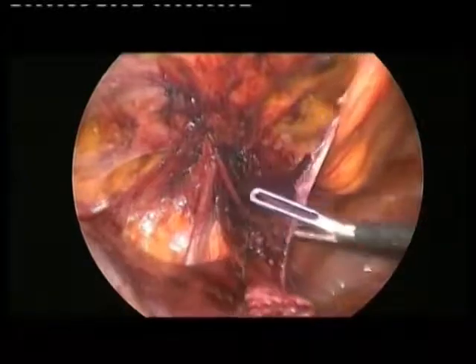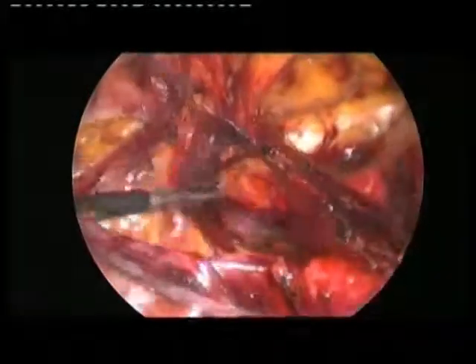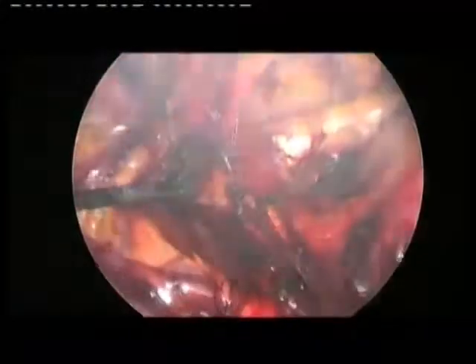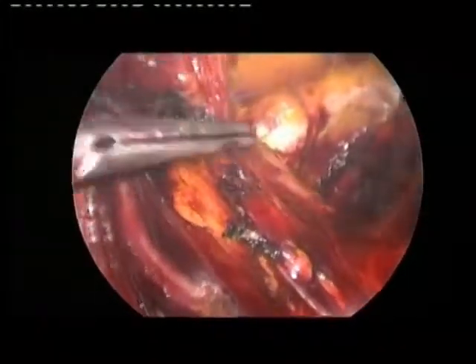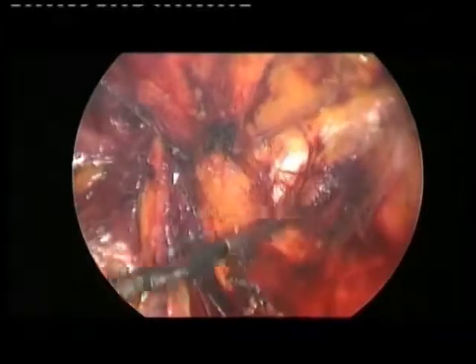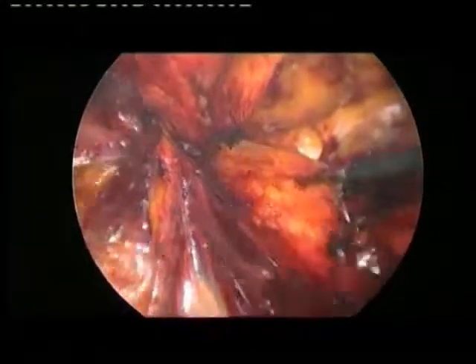Now we are going to work on the crural hernia, okay? The very important advantage of this approach is that you can check all the sites of hernia and you can repair all kinds of hernia. Okay, you see? This big crural hernia is very unusual in a man.